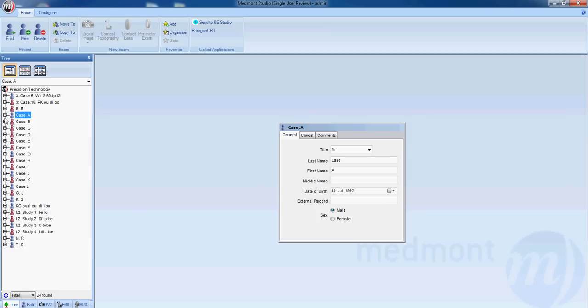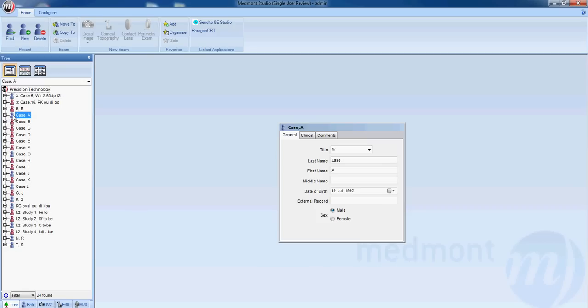You can open up the patient file by clicking once on the plus sign or double clicking on the patient name.